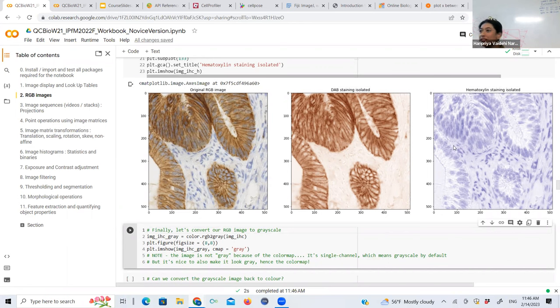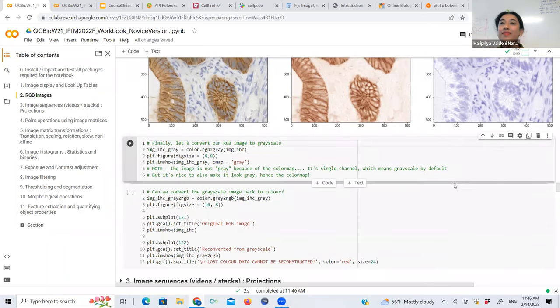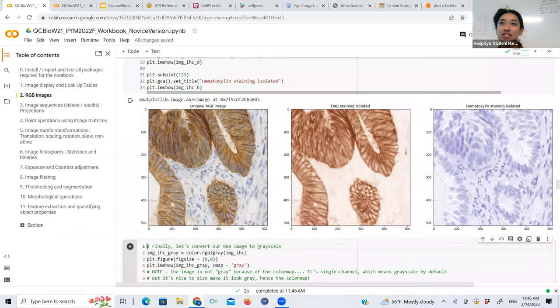There are built-in functions in all image processing software, if you're interested in pathology images, to actually split your stains in different channels. So for very standard staining techniques, you can convert from RGB to that staining color space and switch your images around. Are these messing around with bit rate, like the version we were talking about, or are these gradient changes? Taking very specific combinations of RGB. So it essentially knows that if you do hematoxylin staining, it's a certain proportion of blue plus a certain fraction of red. So it does those kinds of transformations and converts from just your RGB axis to something slightly different, but it's a linear transformation.